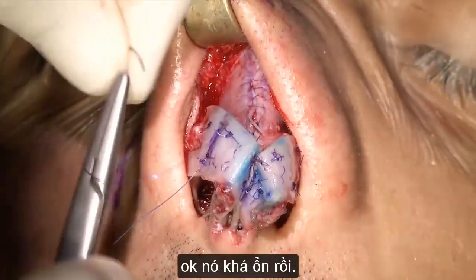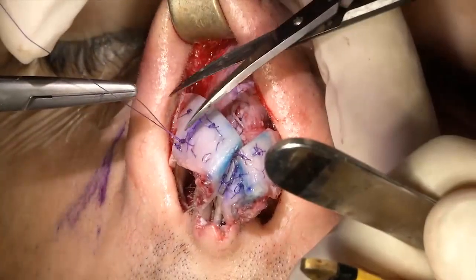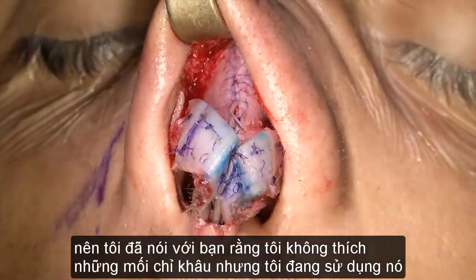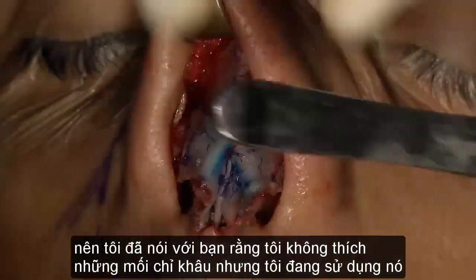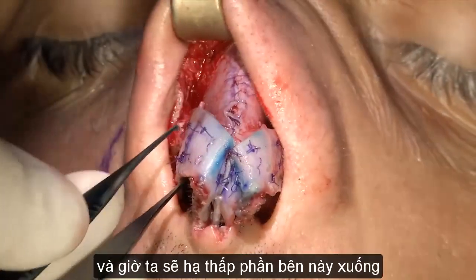Ok, it's decent. So I told you that I don't like these sutures, but I used it now. So let's get this thing down.